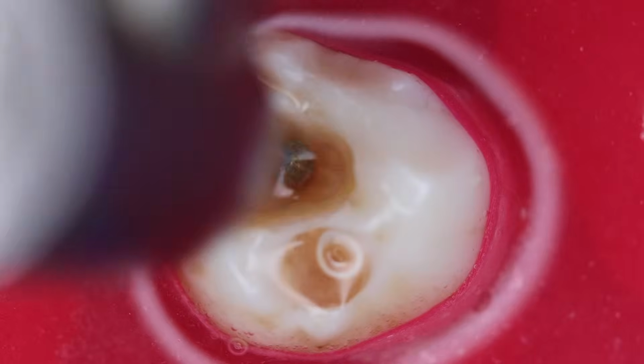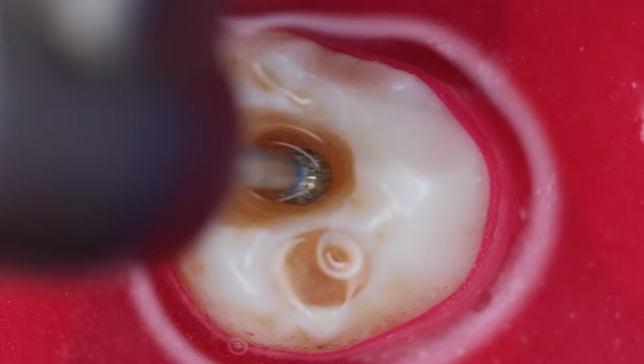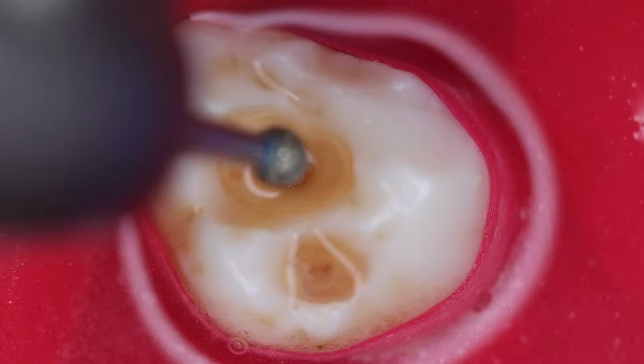Remember, do not go deep inside. Once you have obtained the drop, you need to just concentrate on removing the roof of the pulp chamber.